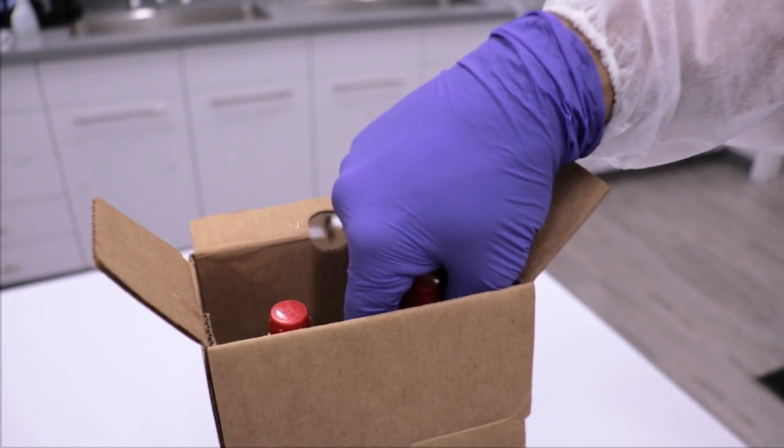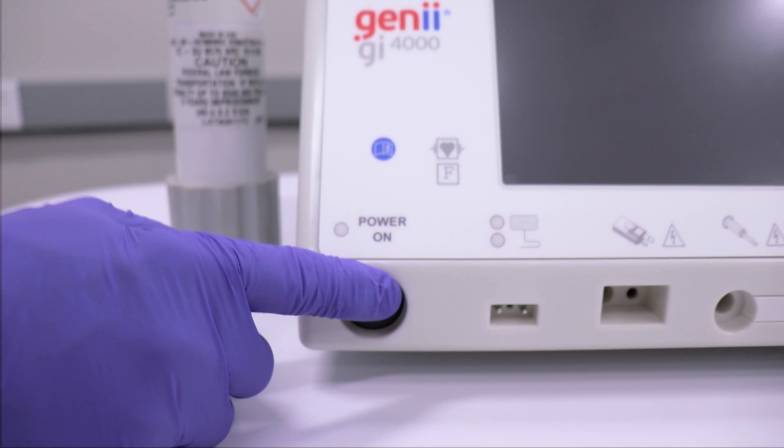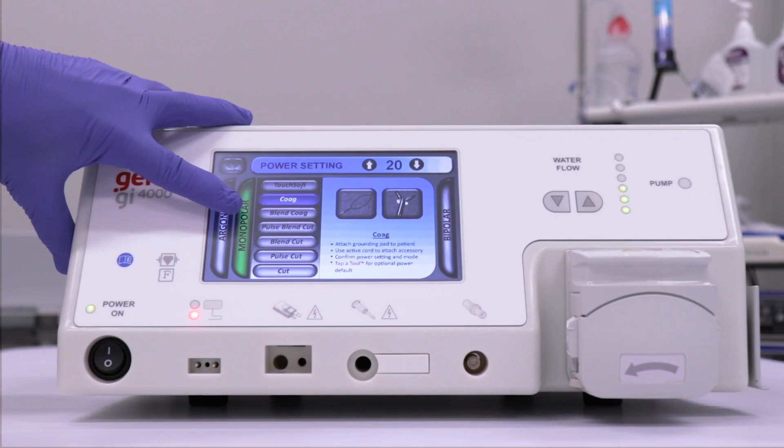To begin, remove the argon gas bottle from the box, then remove the red cap from the bottle and discard. Turn the GI-4000 on by pushing the power on-off switch located on the front panel. Select the argon method on the touch screen.